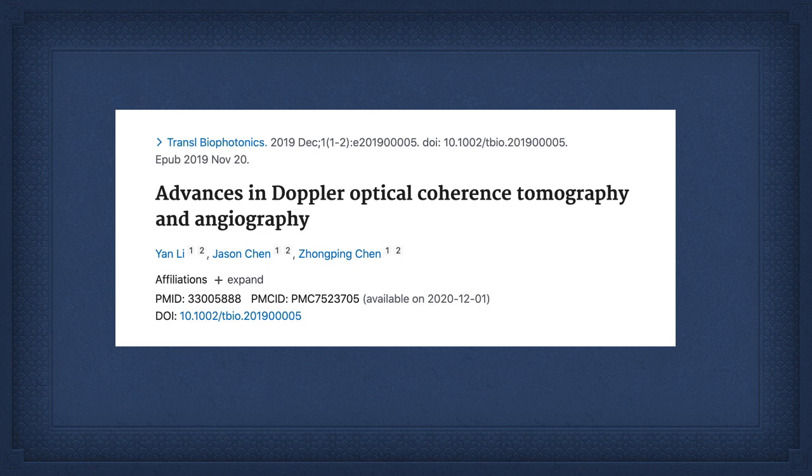Here's an example paper. The Chen group has done a lot of work in this area. It's primarily used in the retina, but in spite of the fact we're interested in angiogenesis, I can't see, based on the speed, the movement, the varying directions of the vessels, it being practically used in the coronary artery. So we've pretty much written this off, unless we have to come back to it because everything else fails, as a technique that's going to be important inside the coronary artery.